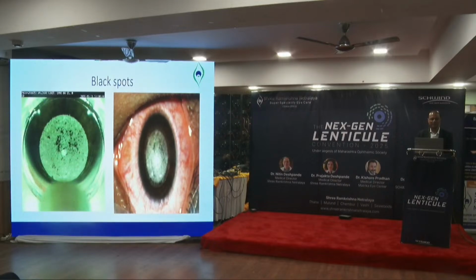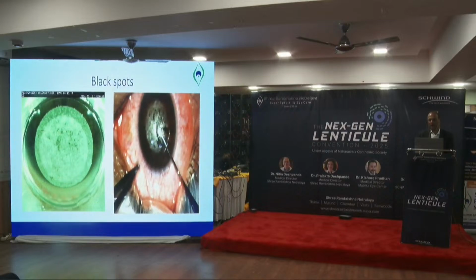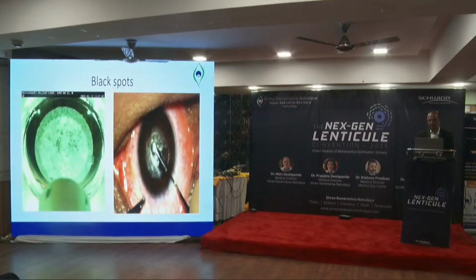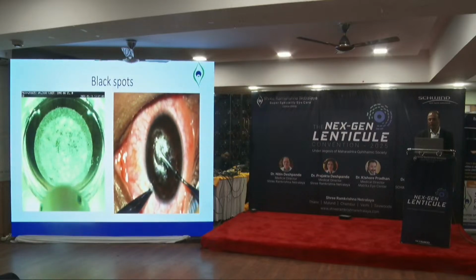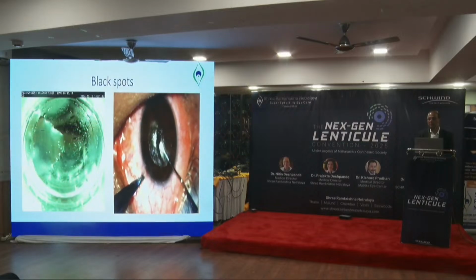And then you can dissect this, but again your visual recovery will be delayed. The patient is going to have some edema the next day. You can see my struggle here. And these are the cases where you can easily have a false plane. So I managed to take the lenticule out, but it was a struggle. So it is very important that your interface is very clean.